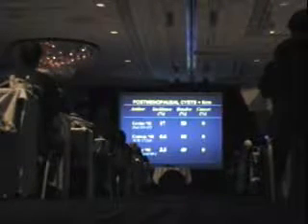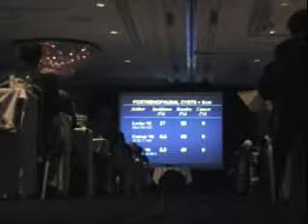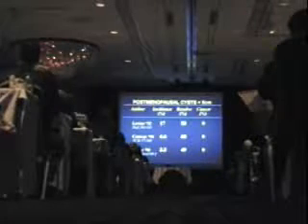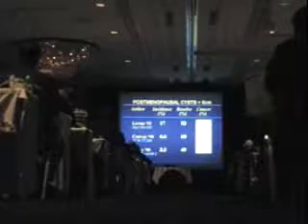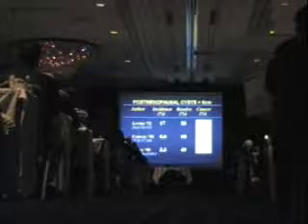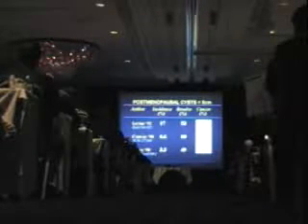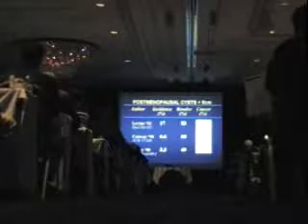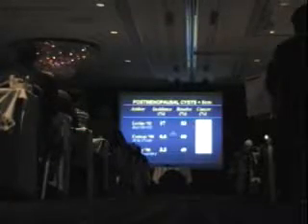Make sure it's avascular. We know from various articles in the literature, and in the literature they're using about 5 centimeters as the cutoff point, under which I perhaps wouldn't worry. Most of these cysts, in truth, are 3 centimeters and less. It's really unusual to have a cyst that's approaching 5 centimeters that's simple in a postmenopausal woman. Most of them are small. But the good news is, if you look at the literature, cancer is really rare. And if you follow these, about half of the time, they will disappear.